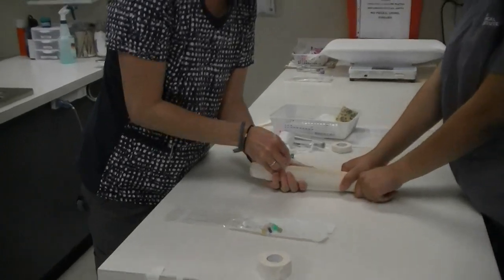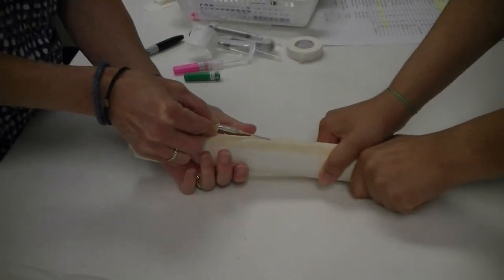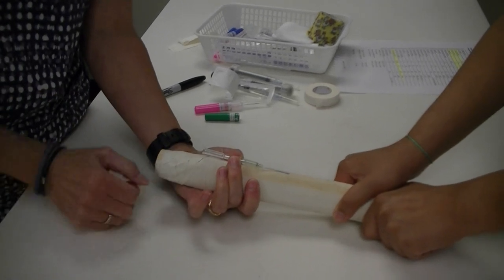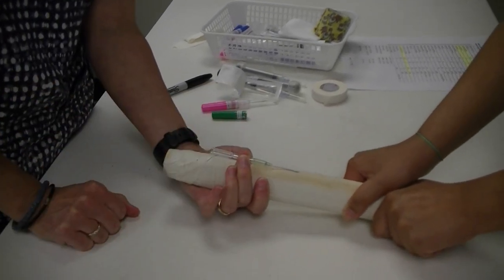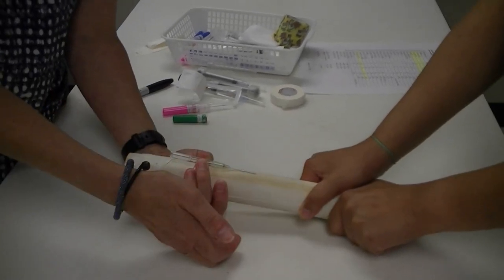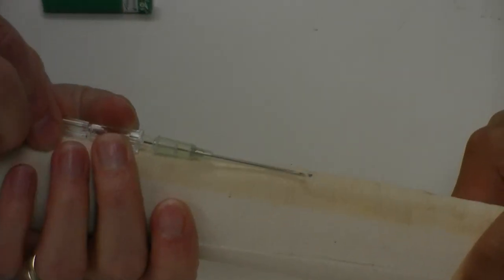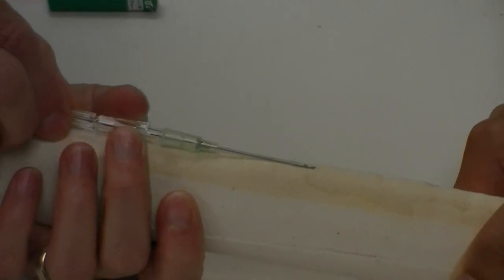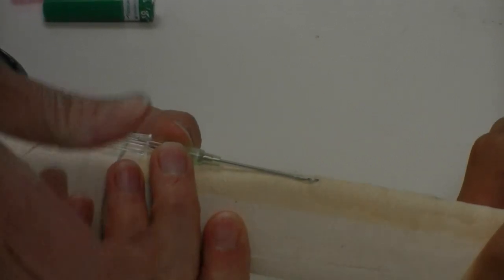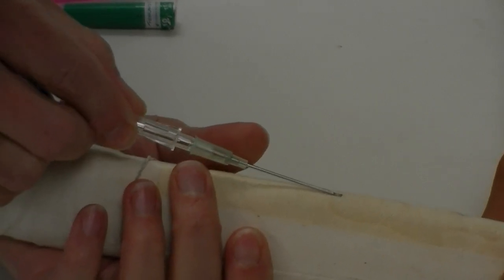The reason it's important to keep in mind that your stylet piece is longer than the actual catheter is that oftentimes you will enter a vein and only the stylet will be in the vein, but you will be seeing flash. Blood will flow into your catheter, and in a large bore catheter like this it will fill up quickly. At that point you'll be very tempted to advance your catheter. However, if only the stylet needle is in the vein, when you try to advance your catheter it will crumple and catch and won't advance forward. With that in mind, I'm going to go ahead and get this through the skin.